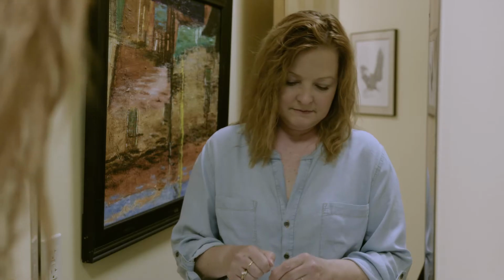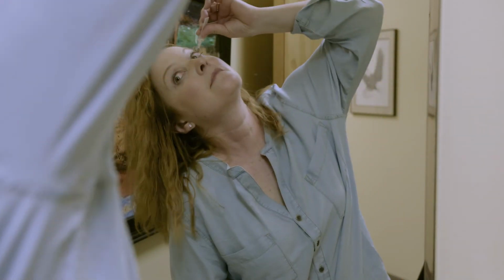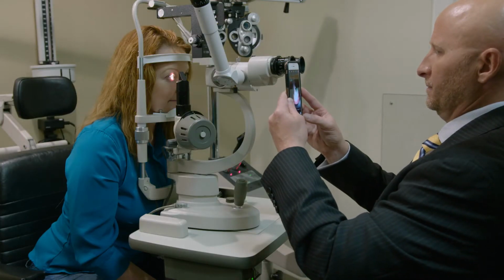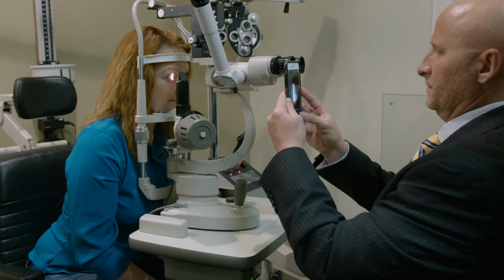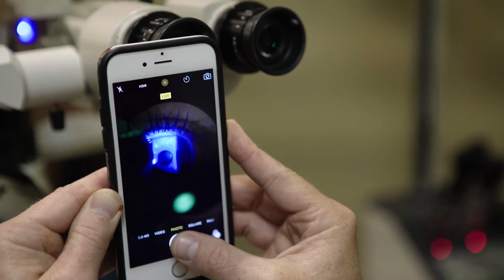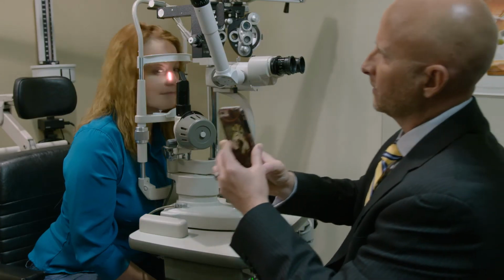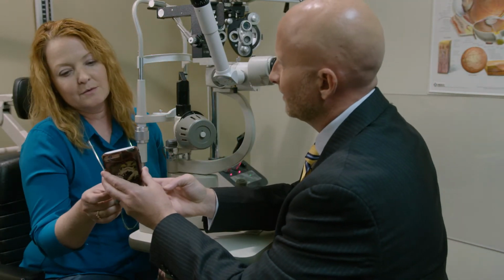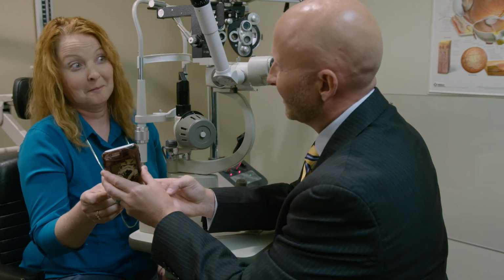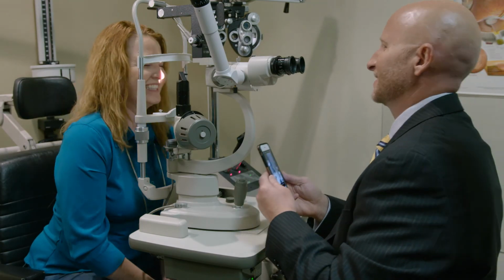Depending on the severity of the glands, anti-infective or anti-inflammatory eye drops and even oral antibiotics like doxycycline can also be effective. But if you want your patients to adhere to their treatment, show them exactly what you are treating. Show your patients a picture of their eyelid staining or their rapid tear film breakup time taken on their own smartphone. It helps them understand this issue with their own eyes when they actually see the test results for themselves. After all, seeing is believing.